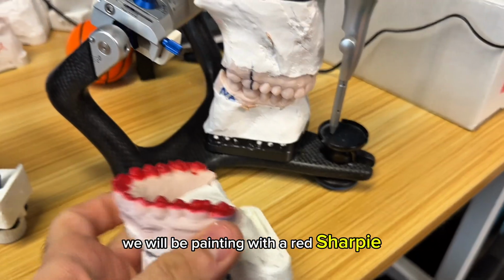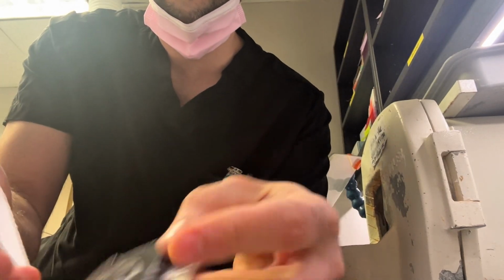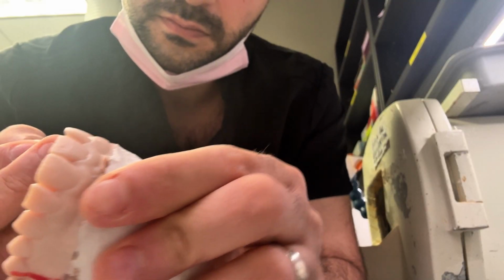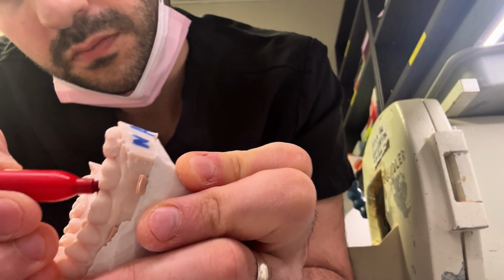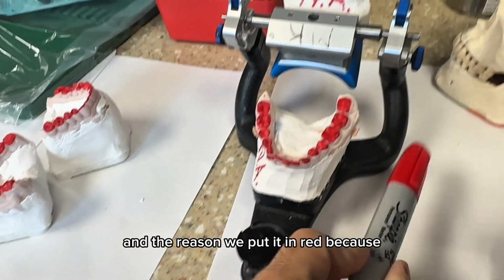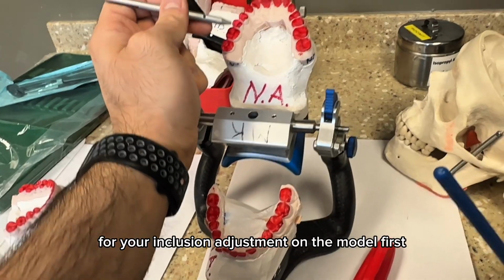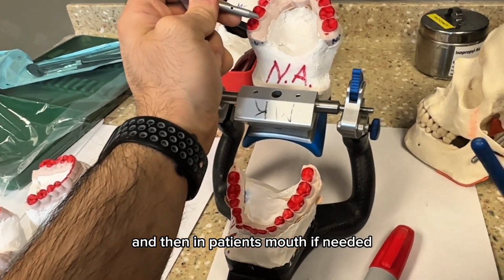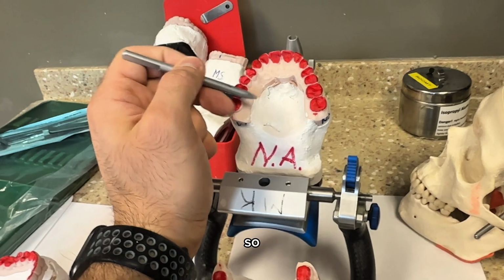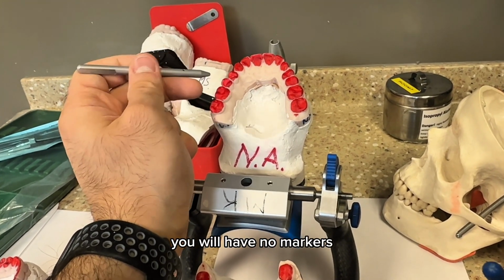Once it's approved, we will be painting the cusps with a red Sharpie to see where we should adjust. After you use the Sharpie, the reason we use red is because once you adjust the cusps, you design your cusps and you might adjust before the patient comes in, a pre-occlusion adjustment on the model first, and then in the patient's mouth if needed. Once you shave it down in here, the red disappears and only the stone color shows up, so this way you know it is exactly where it's marked. Otherwise, if you don't paint, you will have no markers.